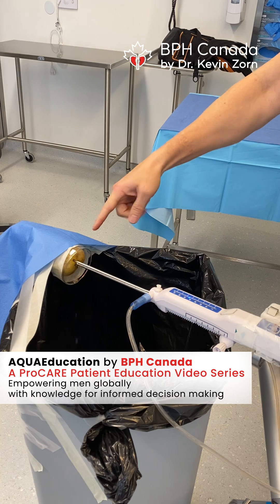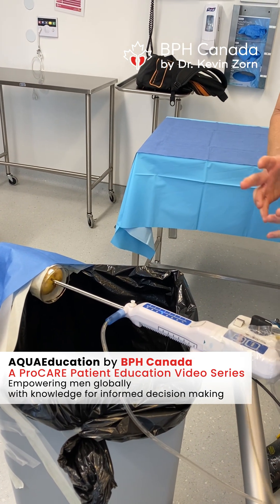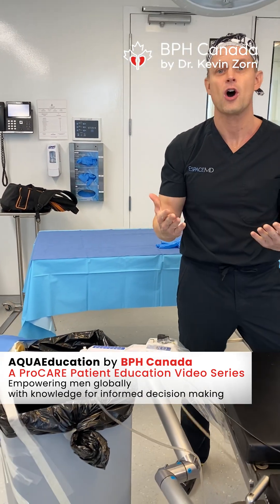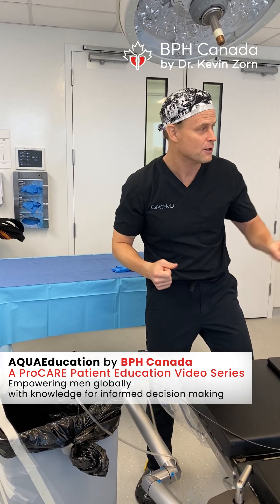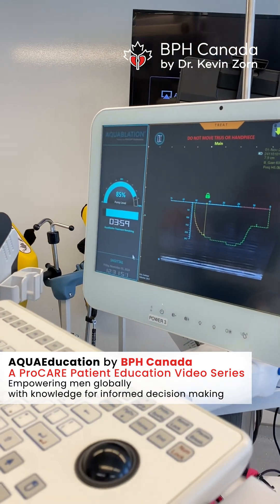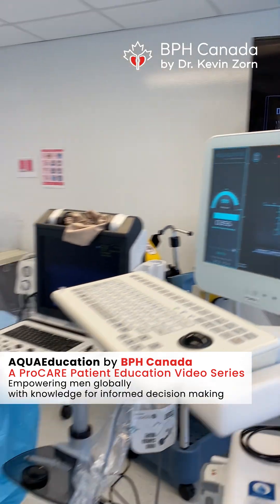This is where the patient's sphincter is. There's no traction, no mechanical stretching that could cause incontinence after the procedure. And as you hear, the sound's getting more powerful. The pump is now at 85%, and there's our time — that's how long it's going to take to create exactly that cavity within the prostate.